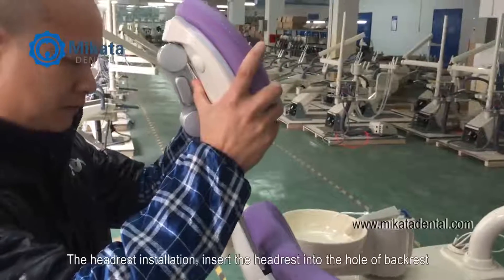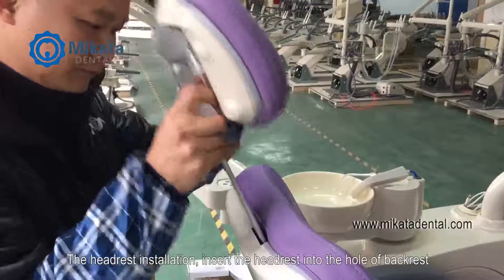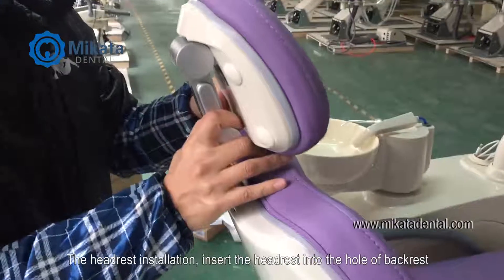Headrest installation. Insert the headrest into the hole of the backrest.